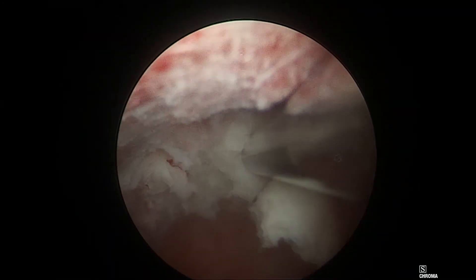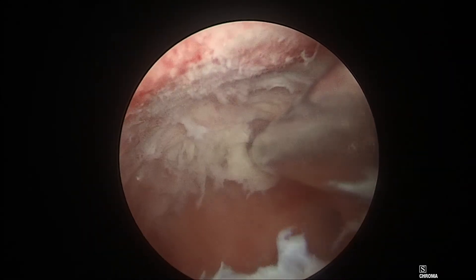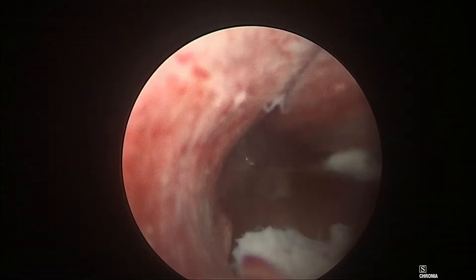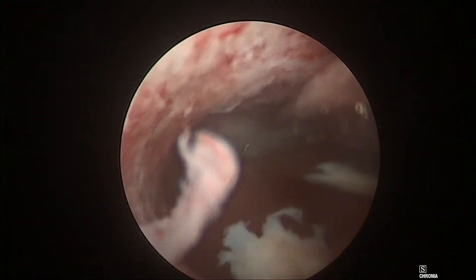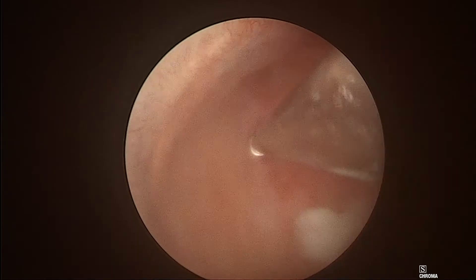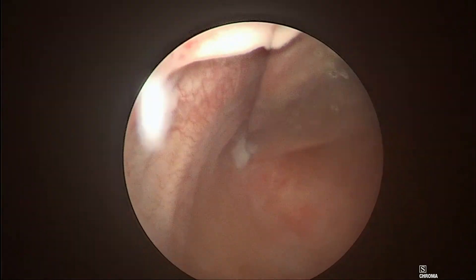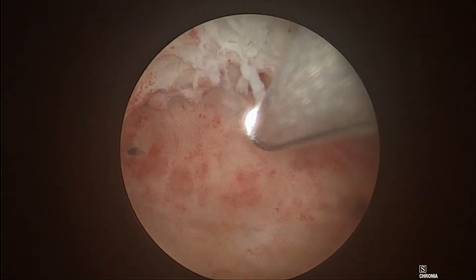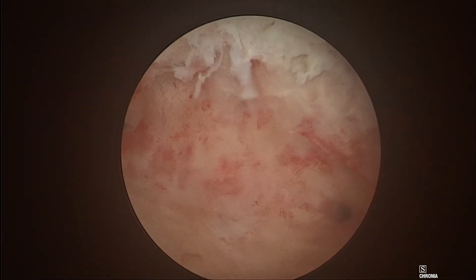It cuts the fibroid into small chips and sucks them out, which go into a separate compartment as compared to the outflow fluid. The last part of the fibroid resection is a bit tricky and every care should be taken to resect it. Small chips of the fibroid which are moving in the cavity during the resection can be taken out later on. Overall procedure time was around five minutes and the patient tolerated the procedure very well, going home immediately after.